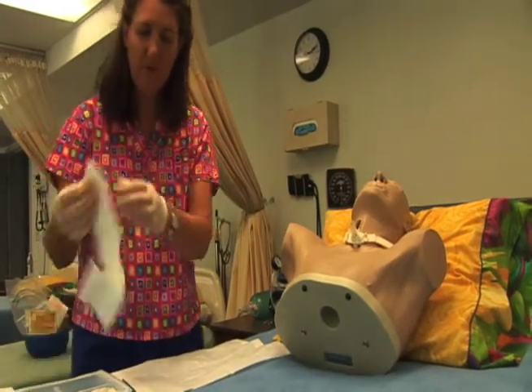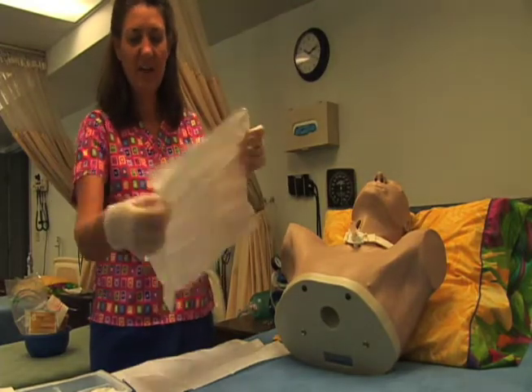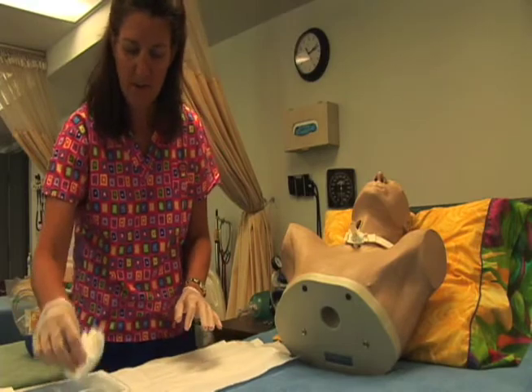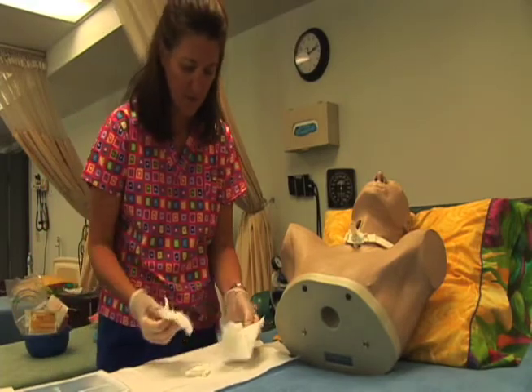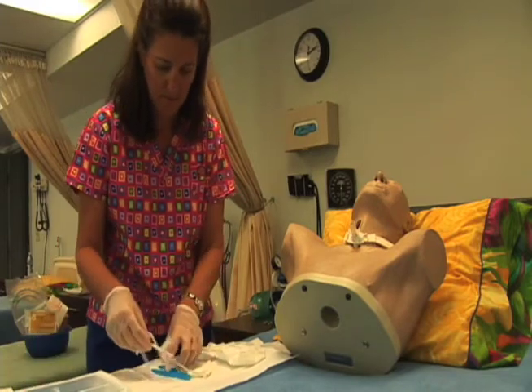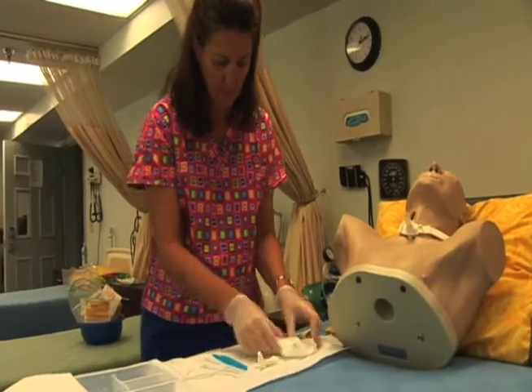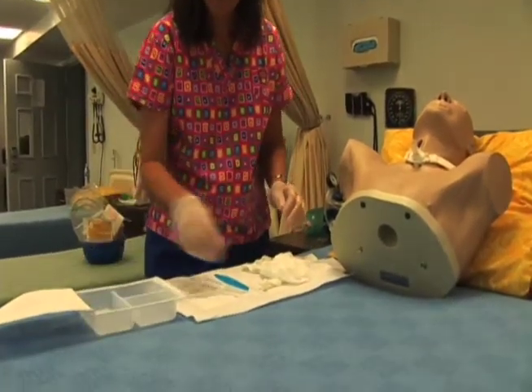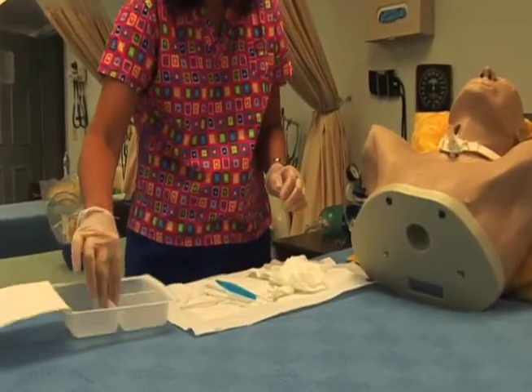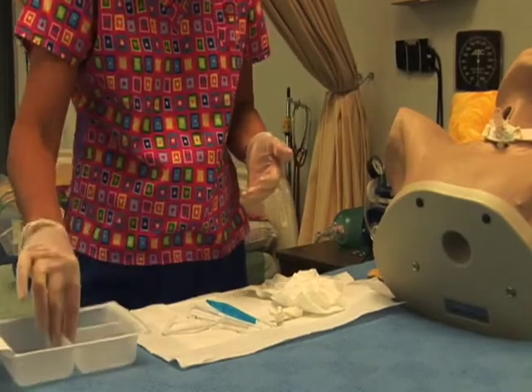Okay, at this point we can pull out our equipment and see what we have. This has a shiny side and a flat side, so I'm going to put it right down here so I can get my equipment out and see what we have. You can touch this on the inside because your hand is sterile, but you can't set it on here because this is unsterile and it will contaminate it.